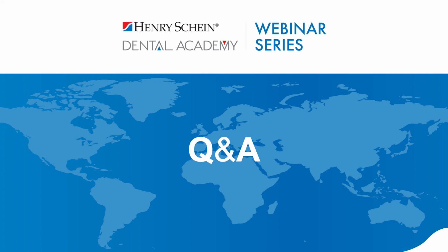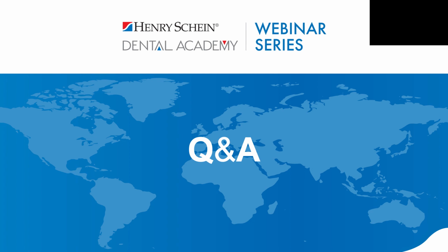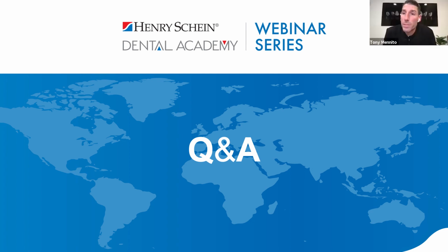Great, thank you. We have another question from Alyssa, who asks, are we bonding the interior of the crown after primer? And this is for zirconia and glass ionomer. So no, you are not. You mean, are you putting bonding agent on the internal surface of the crown? I think if I understand the question, you would not generally do that. There are some people who will do that for veneers because it helps the cement wet against the internal surface of the veneer a little bit better. But aside from that, you don't really need to do that. The exception might be composite materials.